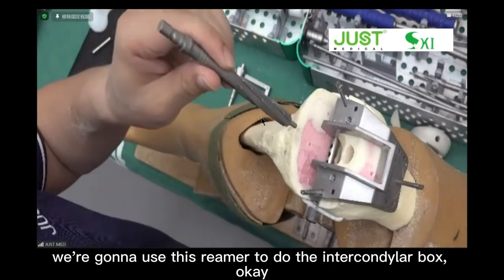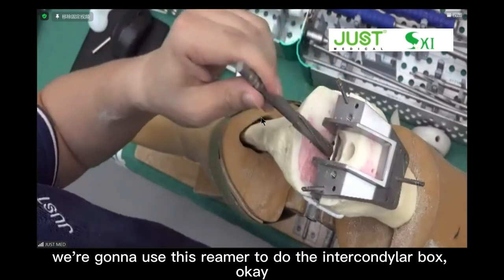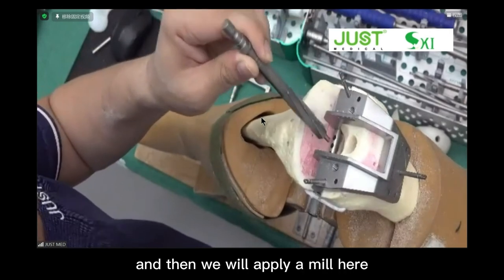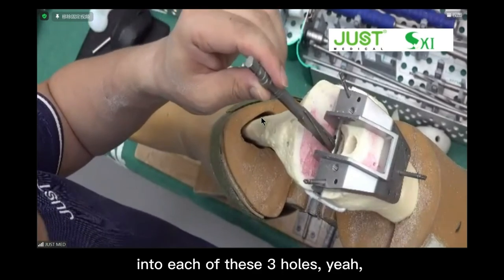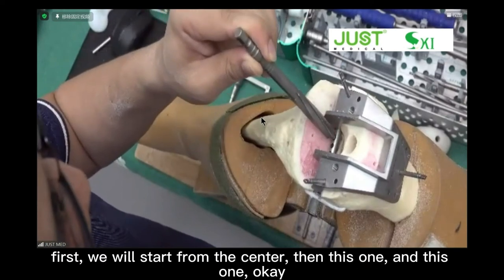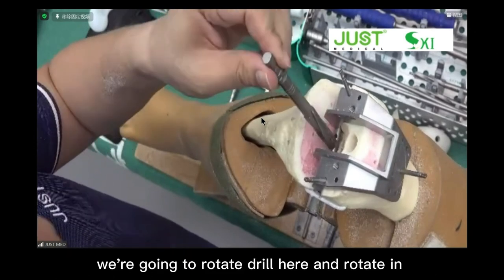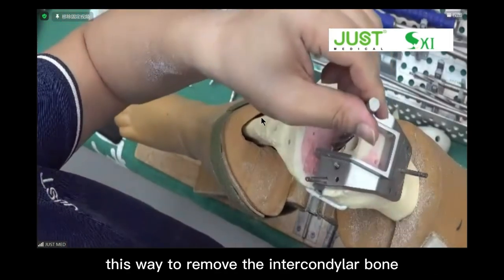We're gonna use this to do the intercondylar box. Okay. There's an axle here. Axle with three holes posteriorly, and then we will apply a mill here into each of these three holes. Yeah. First, we'll start from the center, then this one, then this one. We're gonna rotate, drill here, and then rotate this way to remove the intercondylar bone.